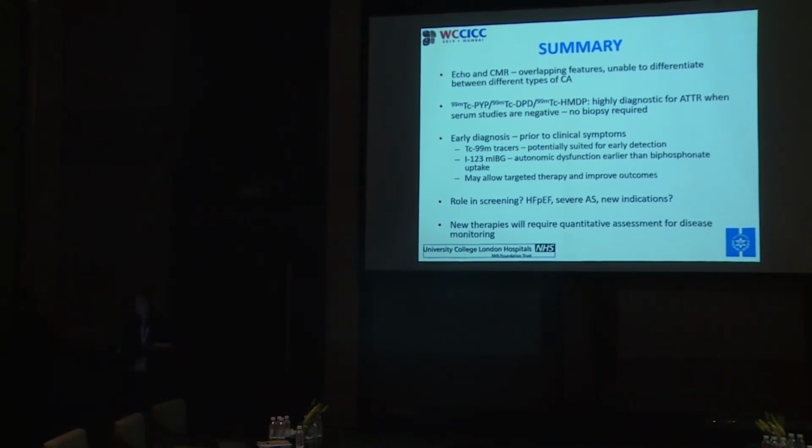Is there a role in screening? There may be. And there are new therapies which will require quantitative assessment for disease monitoring, so quantitative SPECT or quantitative PET may become very important in the near future.